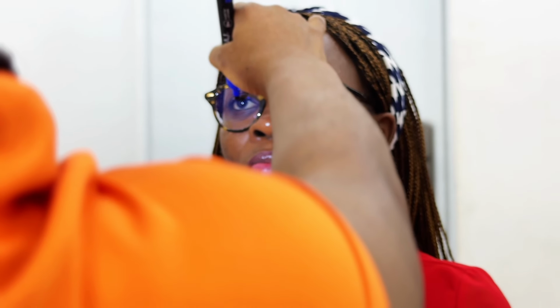I'm still seated 40 cm away from my patient. So I close my right eye and tell my patient to look at my left eye. I dot the center of the pupil. And then I close the left eye. My patient looks at my right eye. I dot the center of her pupil. So once that is done, I will take off her glasses.